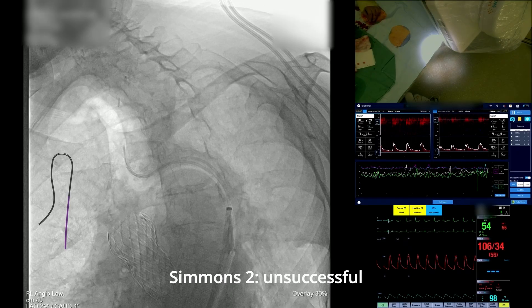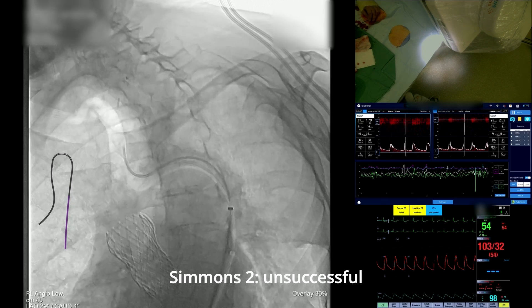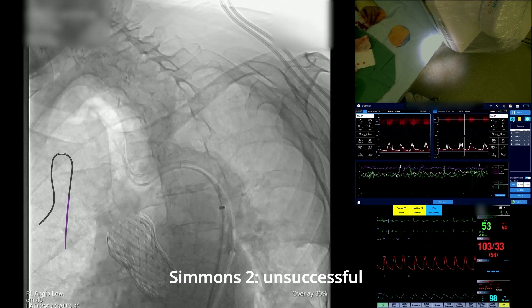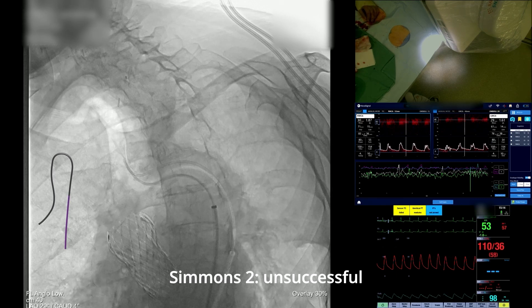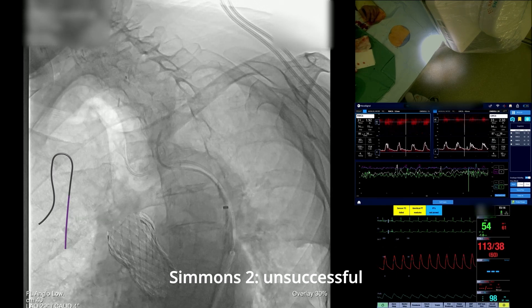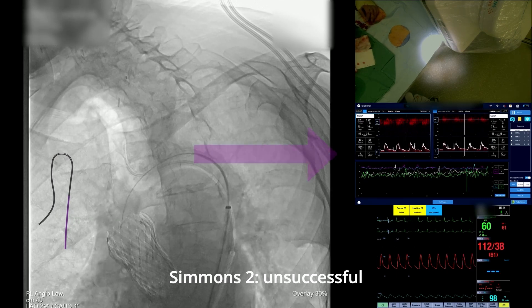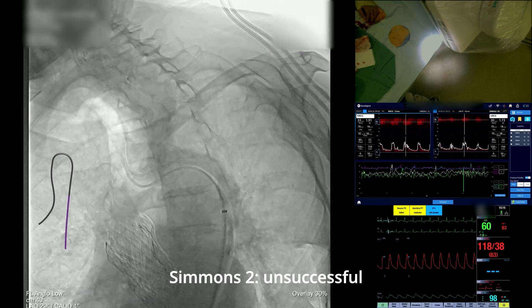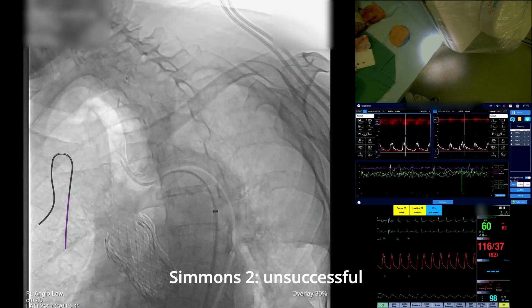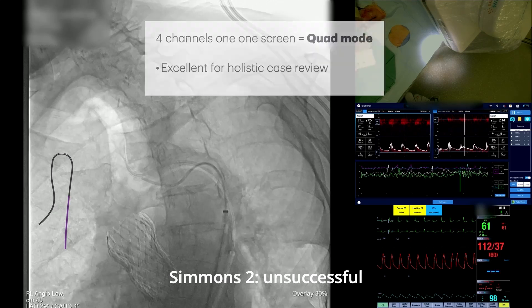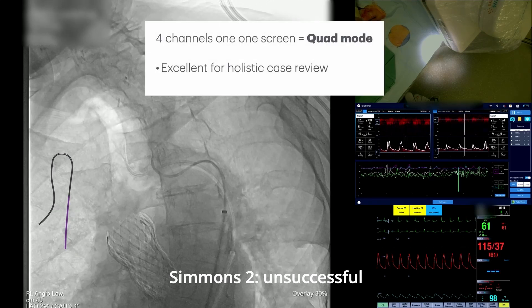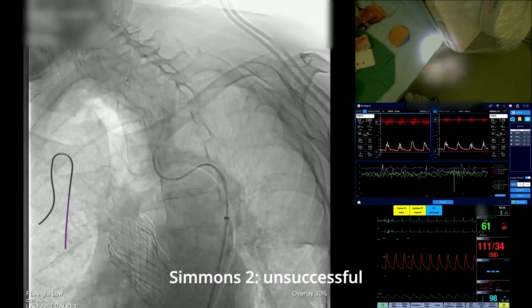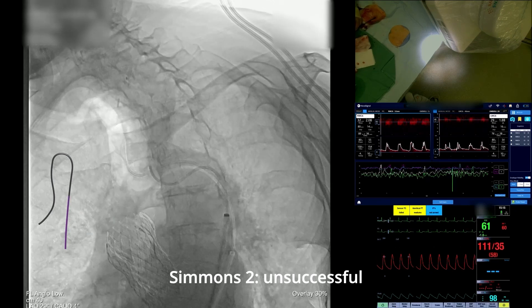After ultrasound-guided access through the right common femoral artery, a wire-loaded Simmons II catheter was advanced through the aortic arch. Intraoperative transcranial Doppler monitoring is visible on the right side in the middle, the in-light camera in the upper right corner, and the physio monitor in the bottom right corner. These screens are integrated into one screen called quad mode, helping us visualize flow disruption and microembolization related to various procedural steps in real-time.